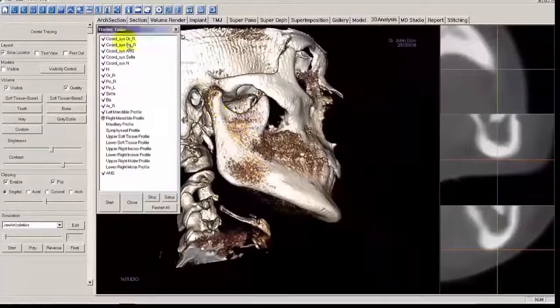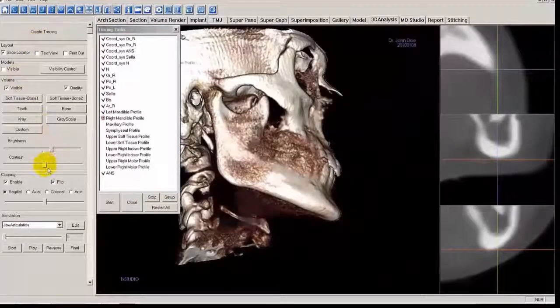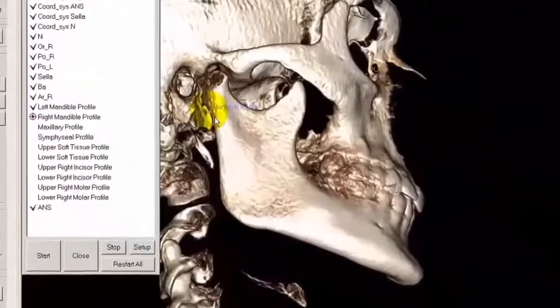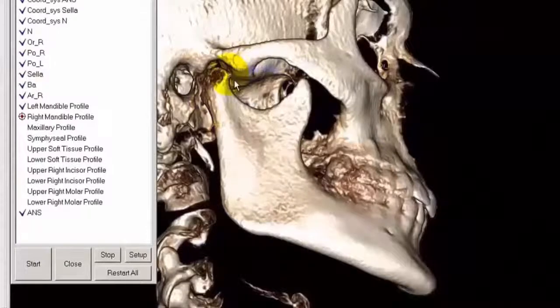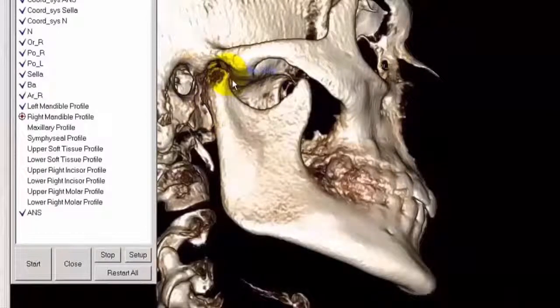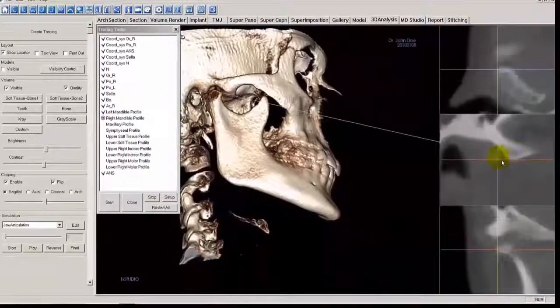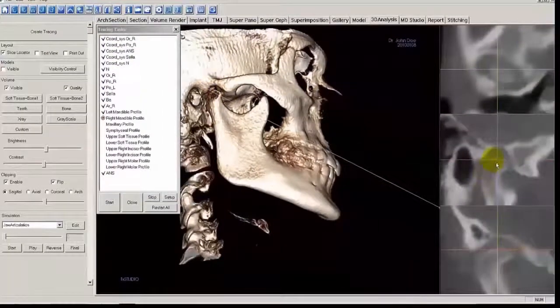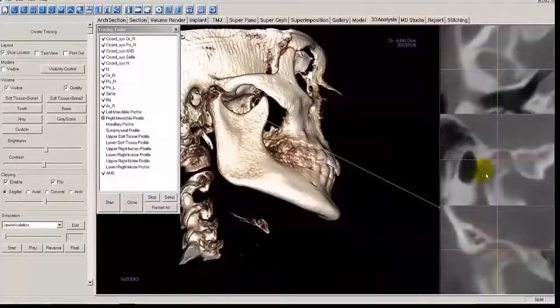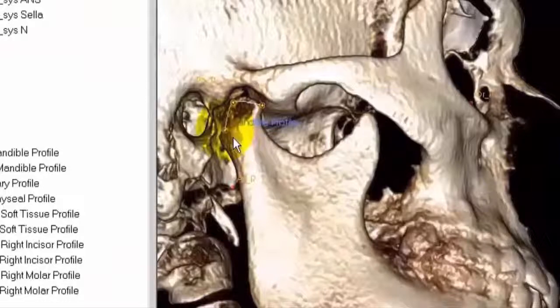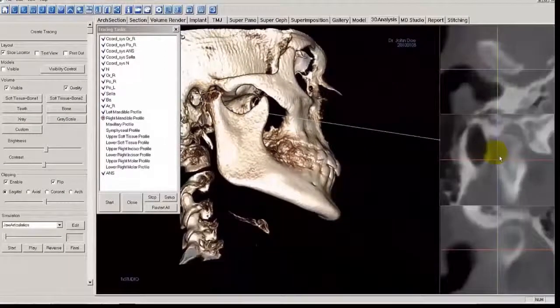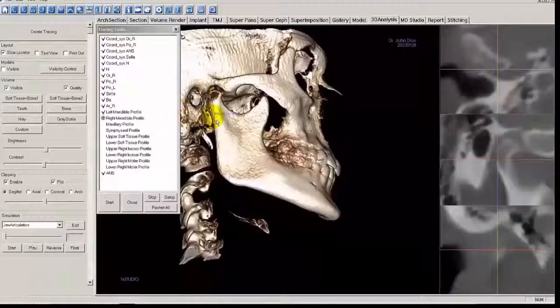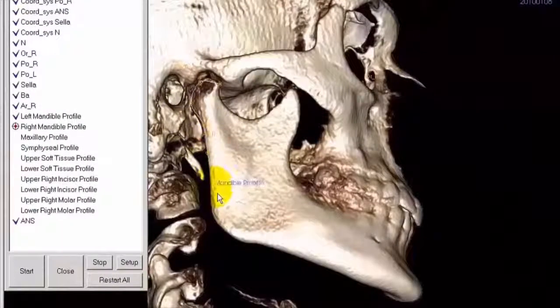We've moved to the Right Mandible Profile. Adjust the brightness and contrast to get a better view. Start at the condylar head — pick out the most anterior point, then the most superior point, then the most posterior point. Then follow the ramus down as we did on the left profile.